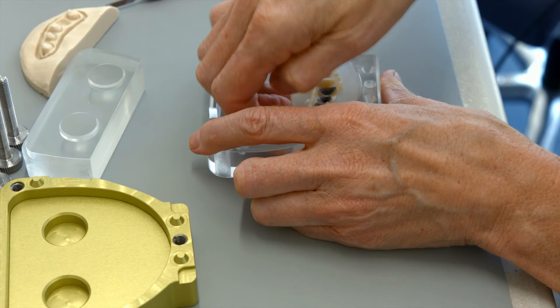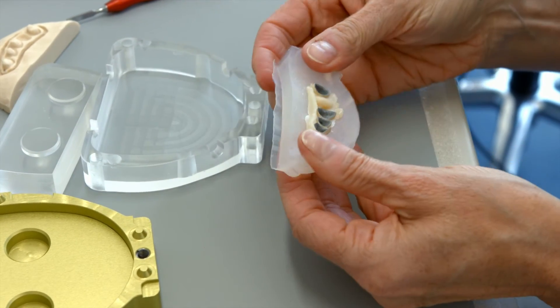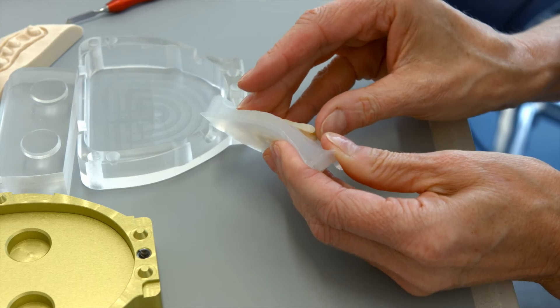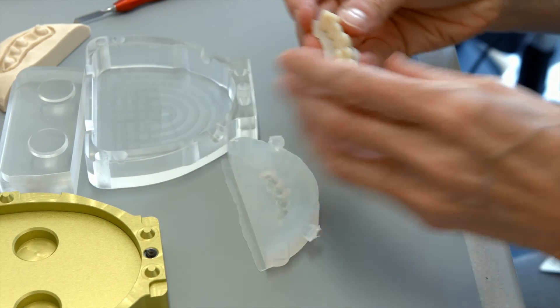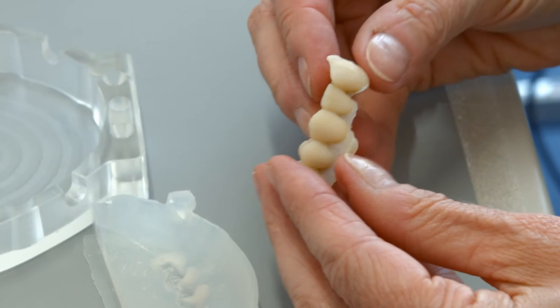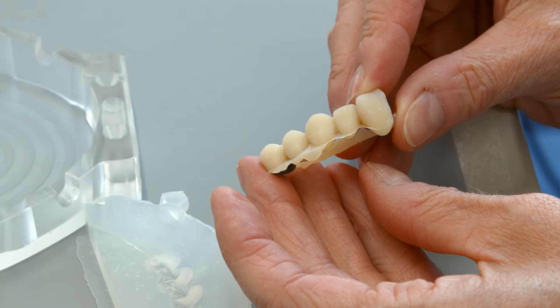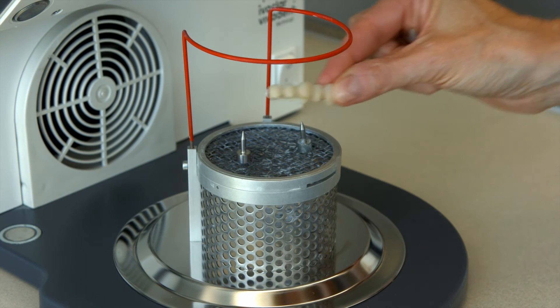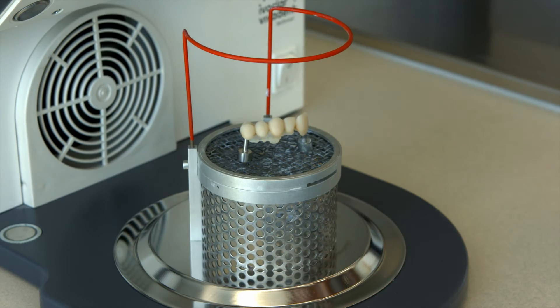Separate the flask halves when the incisal material has been polymerized. Demold the pressed and cured incisal material. It is advisable to remove the silicone from the upper flask half first and then carefully demold the bridge. Polymerize the restoration again separately, without the flask, for example in the LumaMAT, in order to completely cure the composite resin.